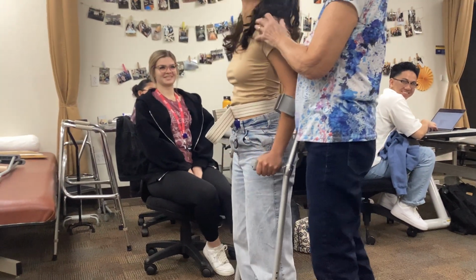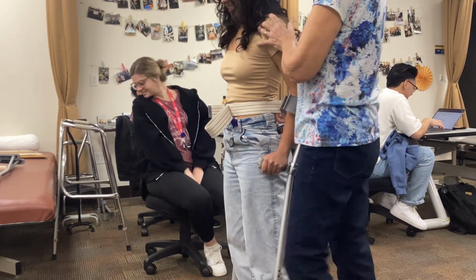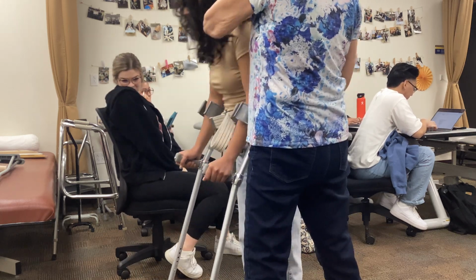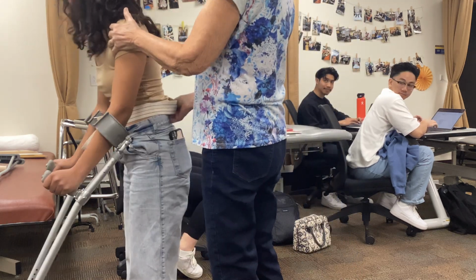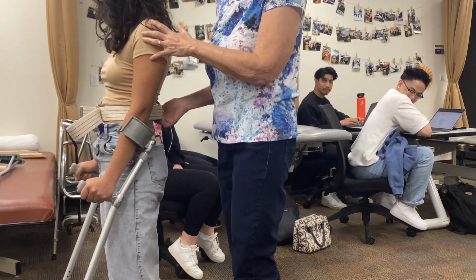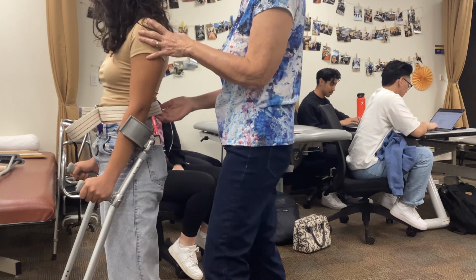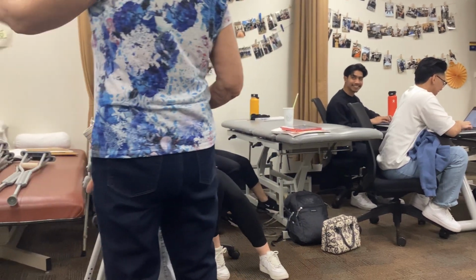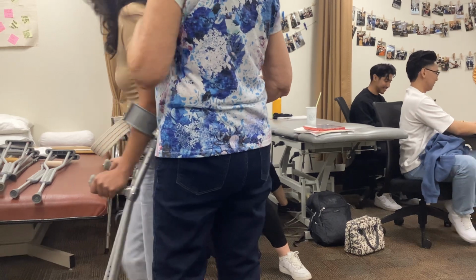Okay. Got that? Having fun yet? No. Alright, let's try it again. So, down. There, that was better, but as soon as you come down, then you go into this C curve. Okay. Alright, ready to try the stairs? Nope. Let's do it though. Let's walk on over there.